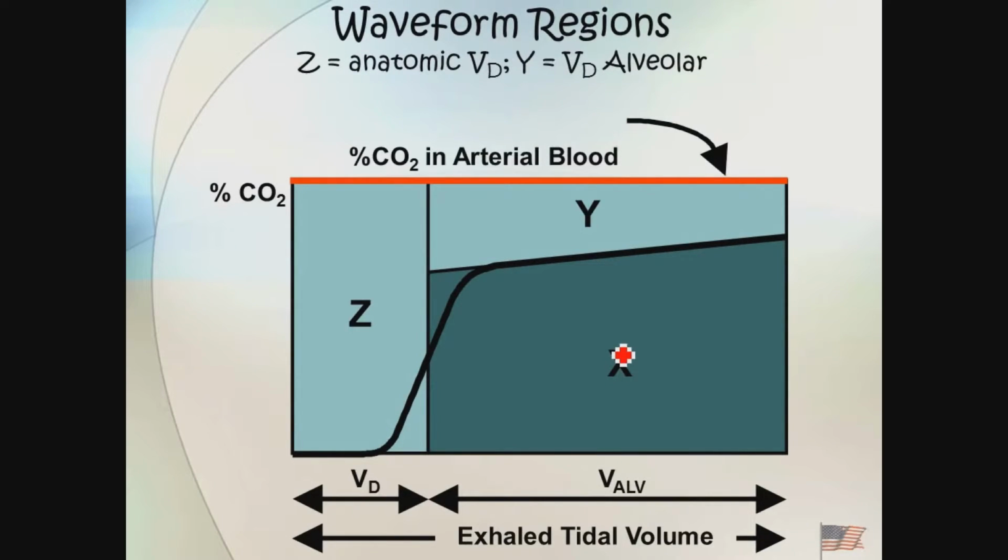The area above that curve, if I measure the carbon dioxide level inside the bloodstream, so if I measure my PaCO2 compared to my end tidal, all of this additional area above is alveolar dead space. Now, under ordinary conditions, the difference between end tidal and arterial should be very small, implying that there's a very minimal amount of alveolar dead space.